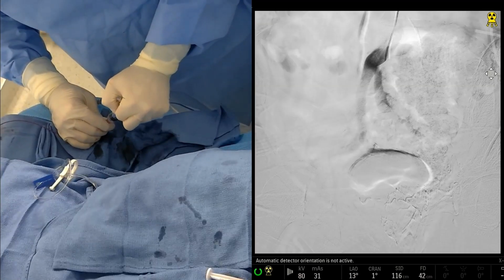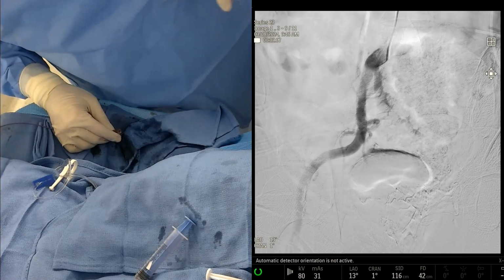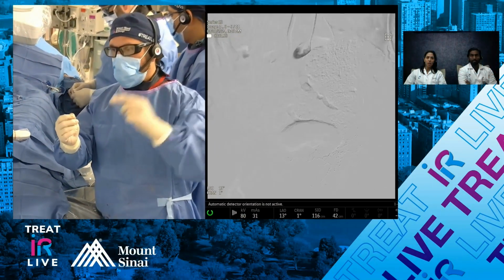Can you guys zoom in on, can I get that smart mask? Go ahead. If you guys want to zoom in on this wire, if you switch cameras, zoom in on this wire.